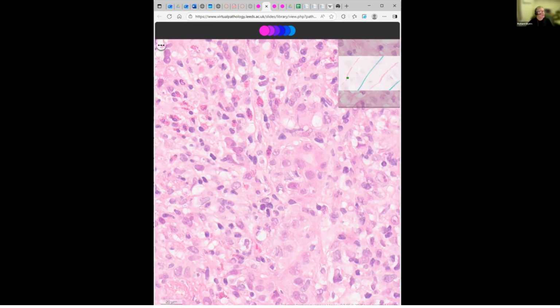Okay, fine. Right. So this is an extremely good answer from both. So you got LCH. So what do you mean, Nengu, by LCH? Can you just spell that out? I can try to unmute and see what happens if someone does want to try to talk. We can test that. So we've got Venkatesh suggesting Hodgkin lymphoma and Nengu suggesting LCH.